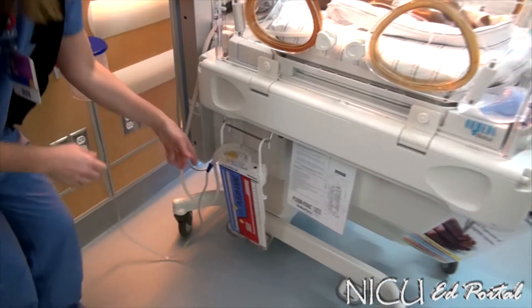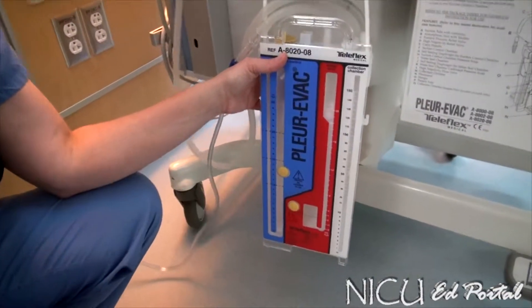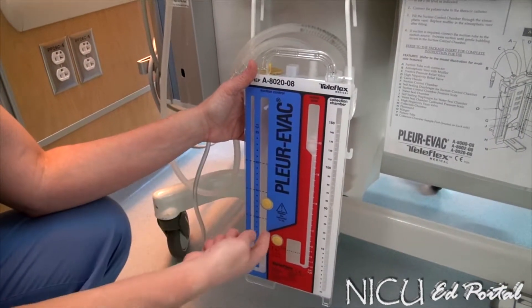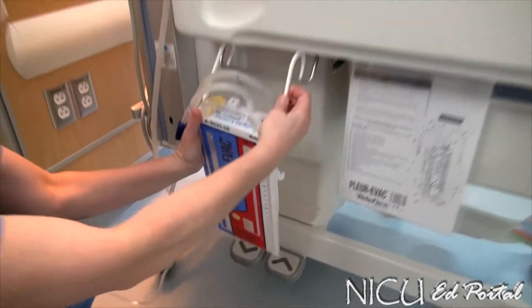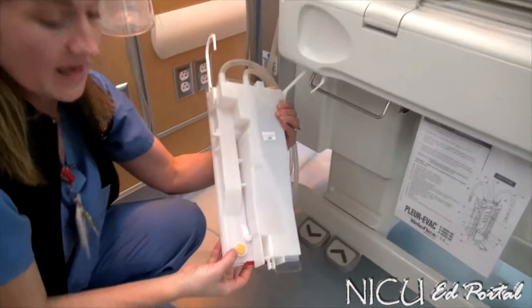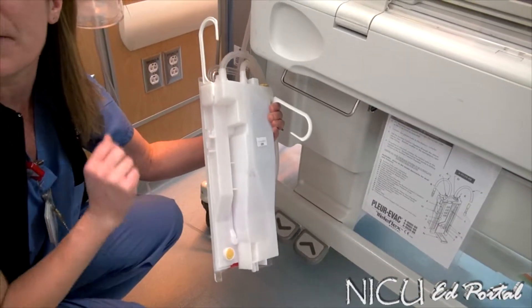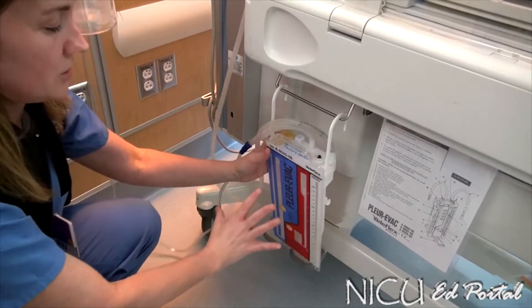In this system, due to evaporation — if the baby has this unit on for a few days — you can actually either inject more water or pull some off if you happen to put too much in. You also have a place in the back where you can draw labs. If you're draining and need to send something off to the lab, you can pull the fluid from there.